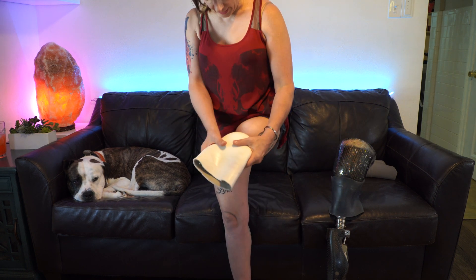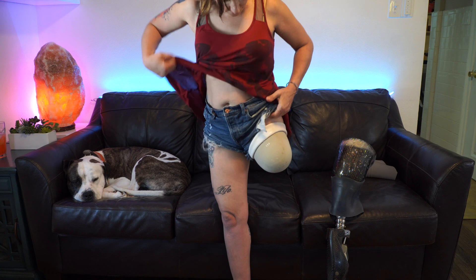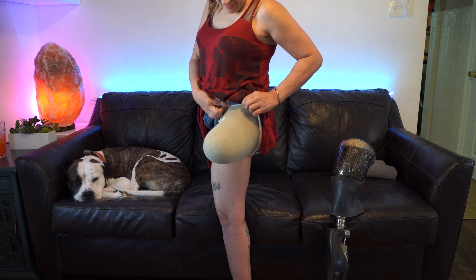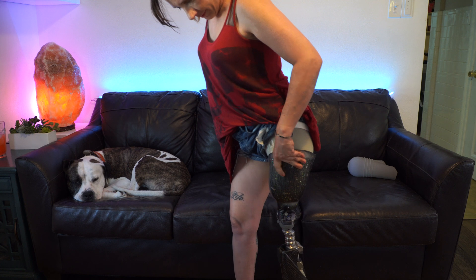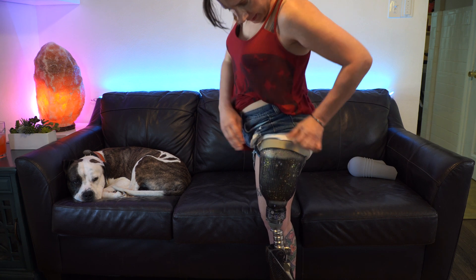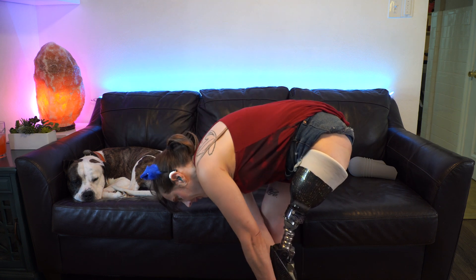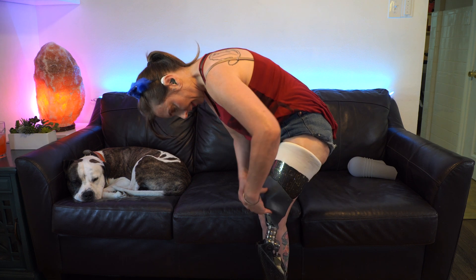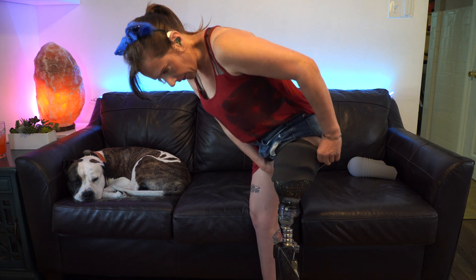I have this liner here — it's an Iseras Synergy liner — and then I have this outer sleeve on my socket. I put on the Synergy liner, and what you can see is it looks too long, and the reason for that is that it's going to be reflected down over the socket. I put the liner on and put my leg on to reflect this down over the socket, and then this sleeve goes over the whole entire thing.